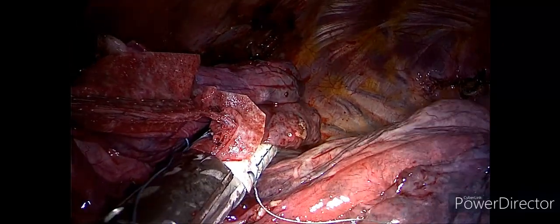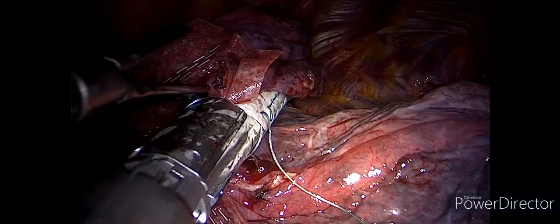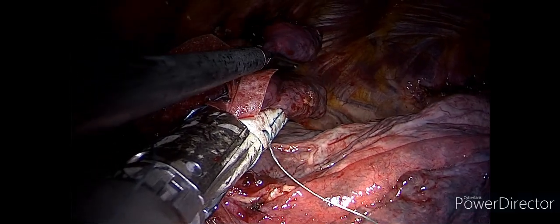This was the biggest bulla we've seen on the CT and clinically, and it took around 2 reloads, or probably 3 reloads, to resect the whole thing.